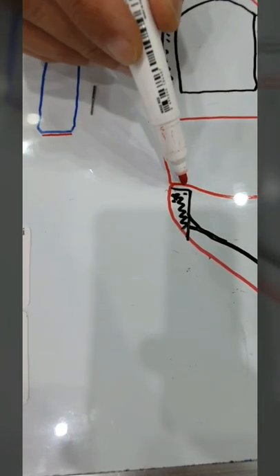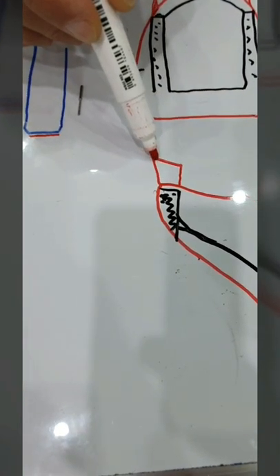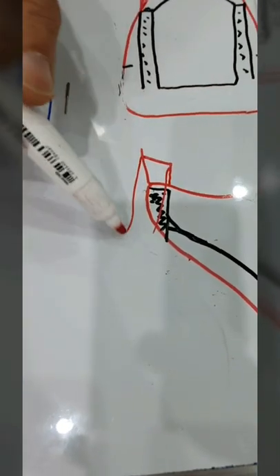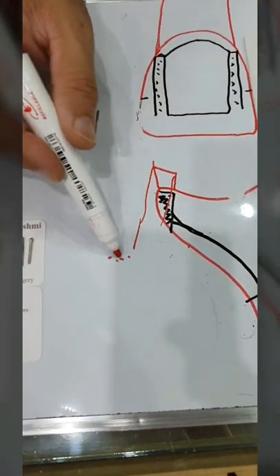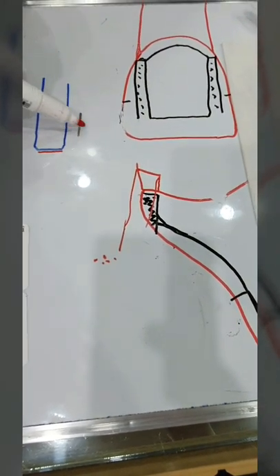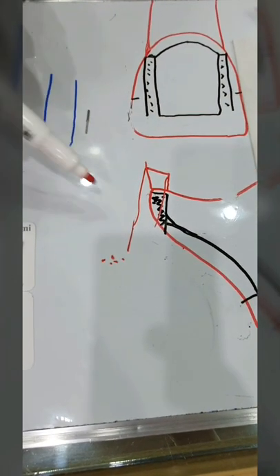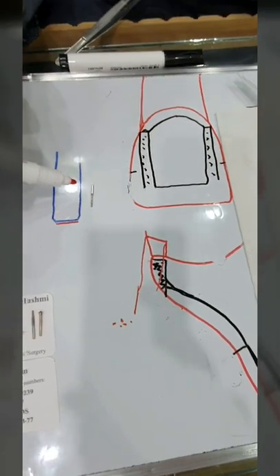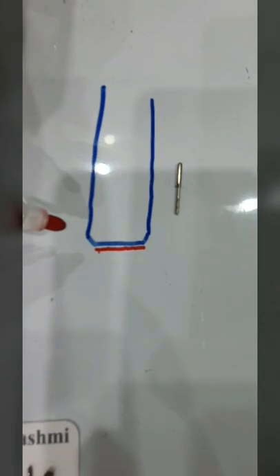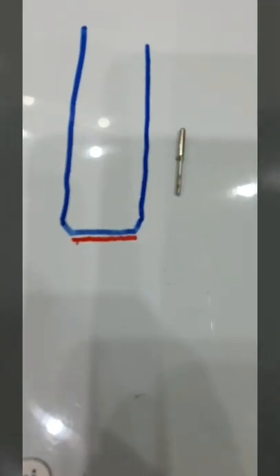So if you're putting an extra bevel right here, so let's say you took the margin further down and you're putting an excessive bevel, interproximally particularly, the angle of the shaft would come out like this and it might touch the adjacent tooth right here. But since this burr does not have any cutting surface, any diamond or any carbide cutting area on the shank, it would just burnish the adjacent tooth without cutting it. The only active surface is at the tip. So you can try to find, if you want, a margin polishing burr, and that would take the margins to a different level for you. Thank you.